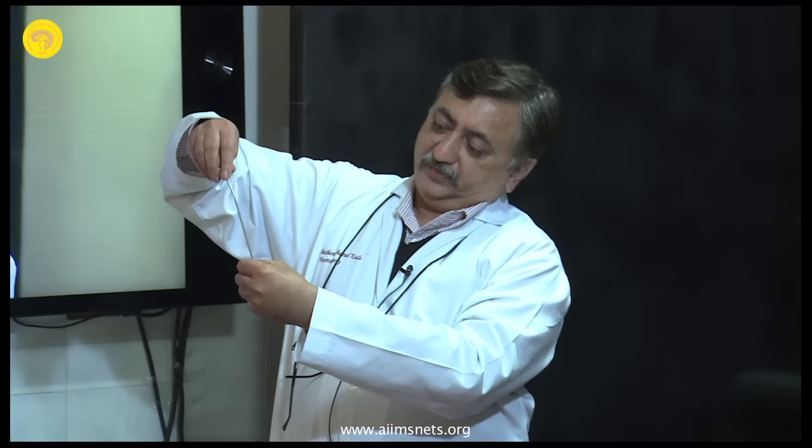What I do is, you identify this joint, you dissect all around it, see the whole joint, till it becomes flat and the surface of the sacrum begins. Keep on dissecting the sacral surface till you see the edge of the S1 foramen. Can you see this? S1 foramen. So you'll be able to identify this whole top of the S1 foramen. It'll be like a hemisphere, half a circle, because you'll expose this whole thing.